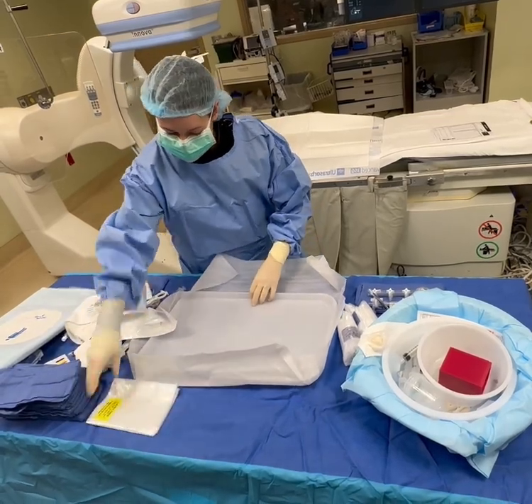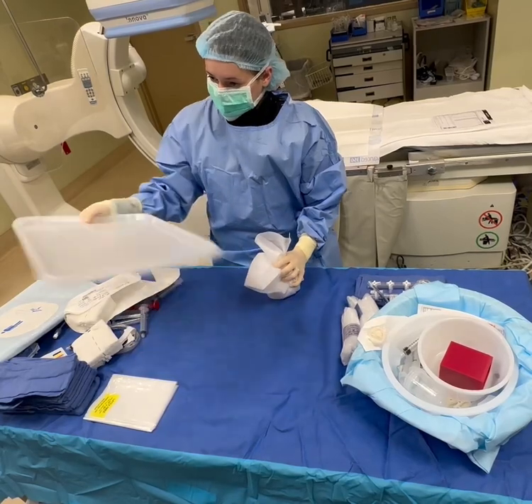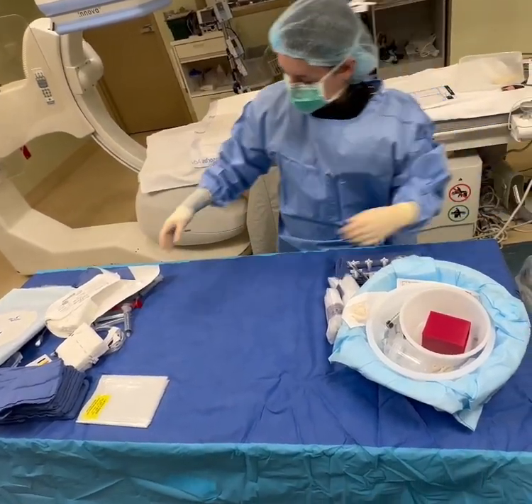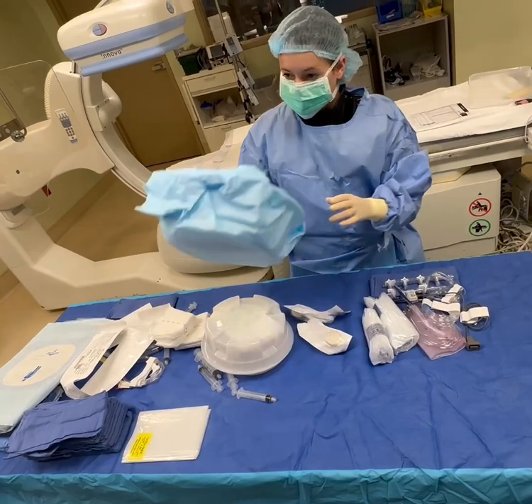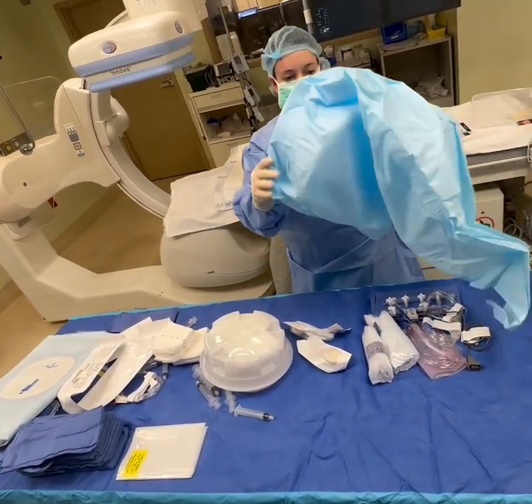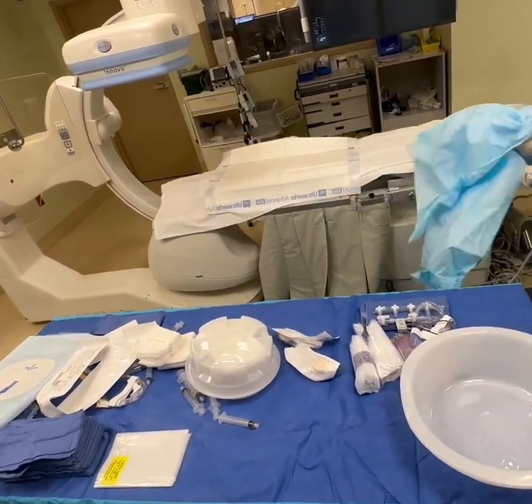Sterile drape just in case anything happens for now. This sheet can be used in procedurals, you know, just kind of moving things. I don't want it because I don't need it. A lot of people like to take this and keep this as well right in there. I don't want it.